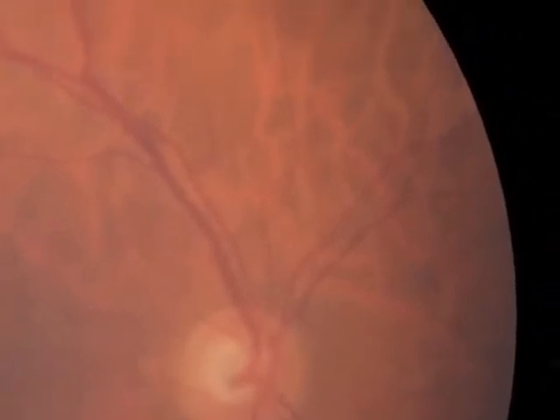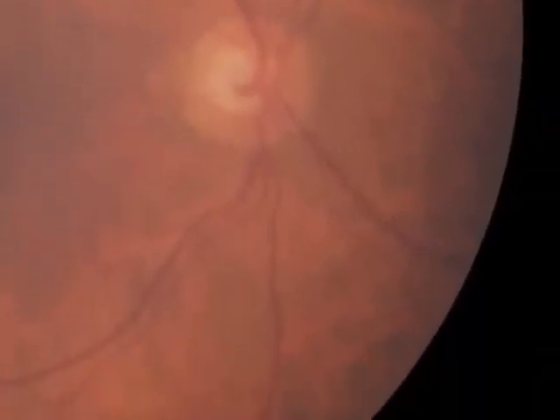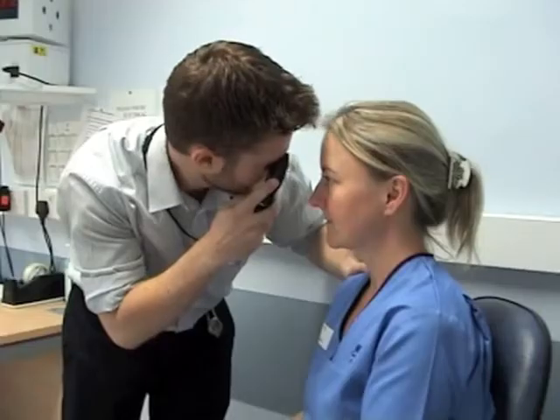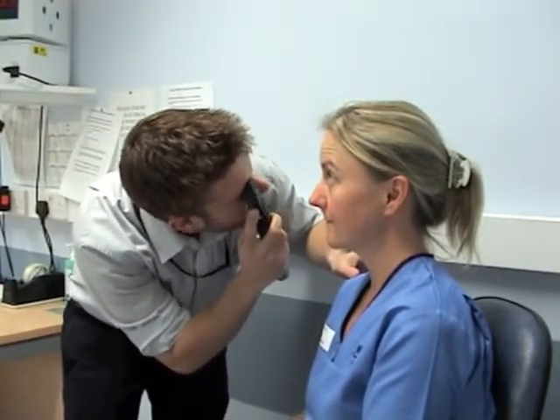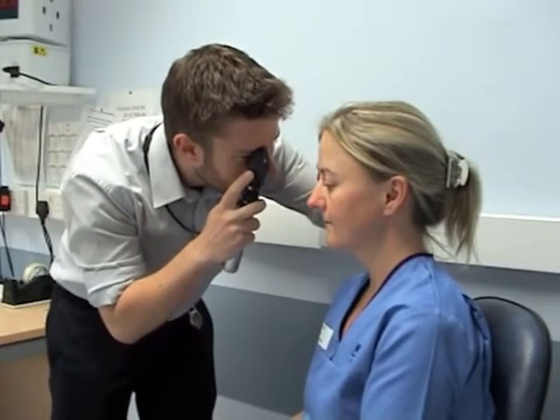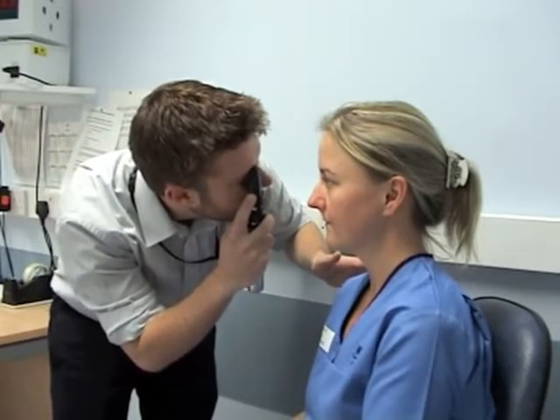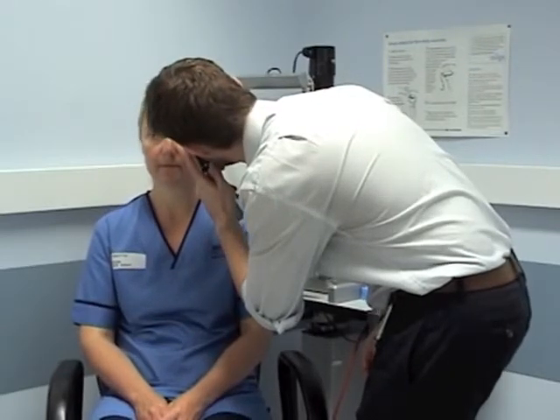supranasal arcade, inferotemporal arcade, infranasal arcade, and finally looking at the macula. It is important that when examining a portion of retina, one asks the patient to look in that direction and moves in the opposite direction. This brings the desired area into view and allows examination of more peripheral retina. Don't forget to use your left hand and left eye when examining the patient's left eye.